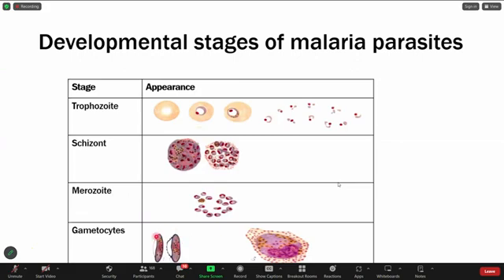gametocytes, which look like this, but they also have the golden yellow malaria pigments, and also this ring of leftover of the red blood cells. Since they are banana-shaped, the red blood cell tends to rupture. Other species have gametocytes that have a big chromatin and a blue cytoplasm. This is also another gametocyte stage, probably of Plasmodium ovale, as we shall see.